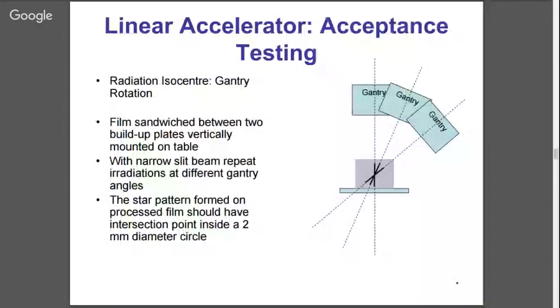Of course, in this plane we are going to have some divergence of the beam, but we can get a reasonably narrow slit beam to do this test.